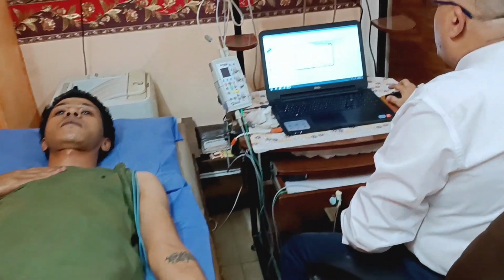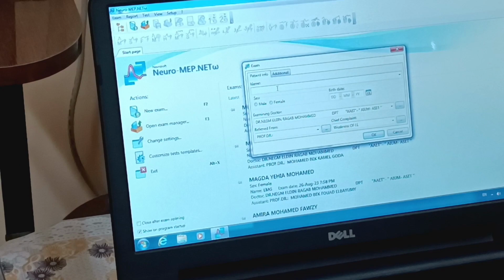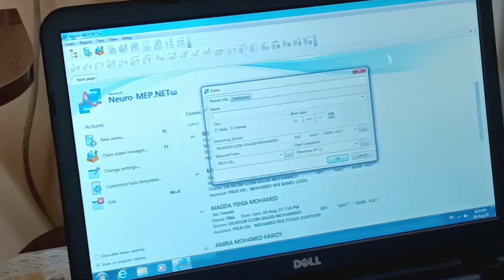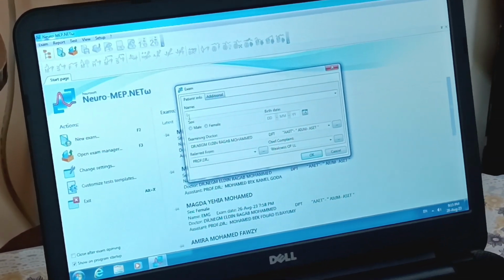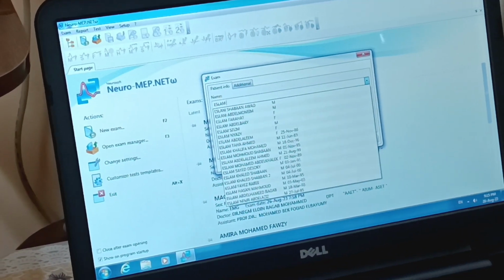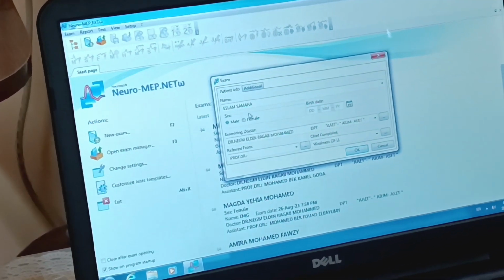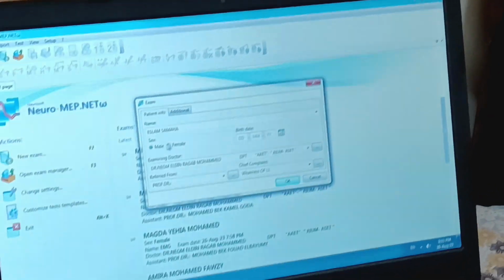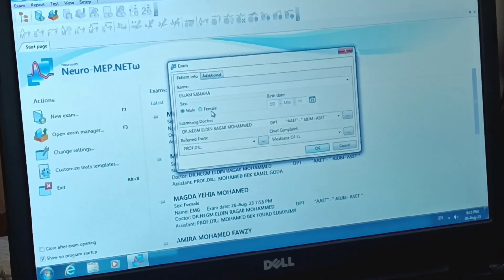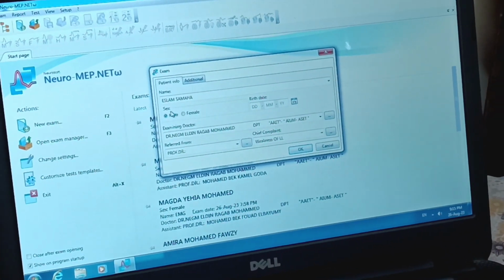Great. If we want to start getting a more obvious trace practically, this is briefly the chart. I will put the full data: the name of the patient, and whether the patient is male or female. It's very important because we have some female pathology and some male pathology predominant, and also in dealing with a female, we must not use a higher stimulation intensity than for the male.